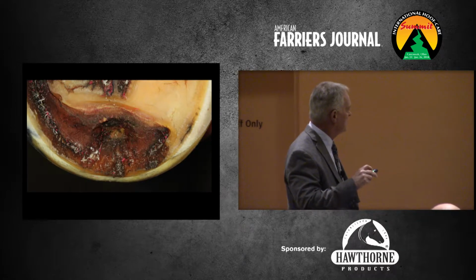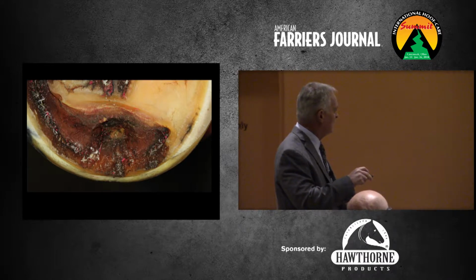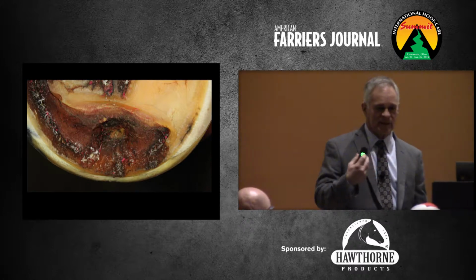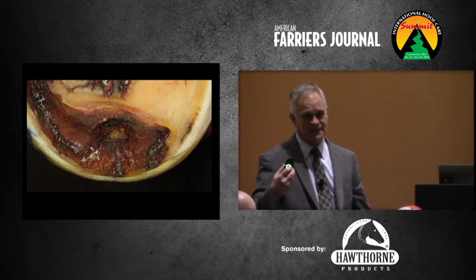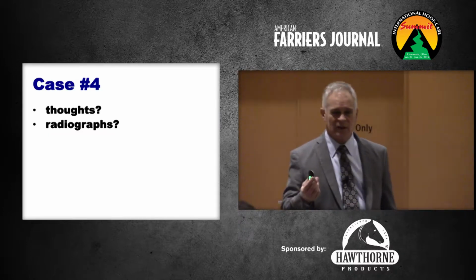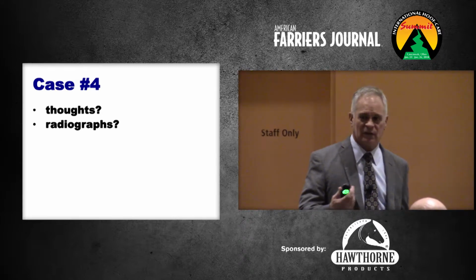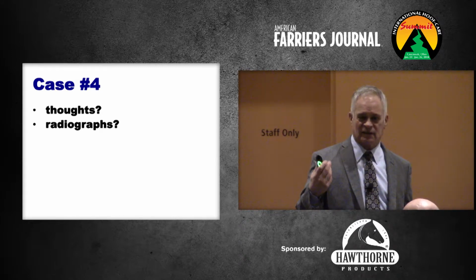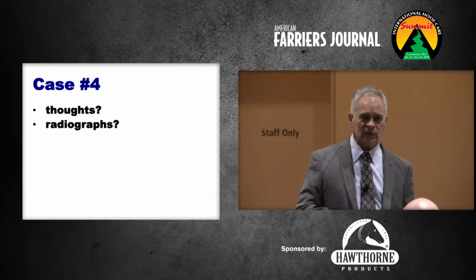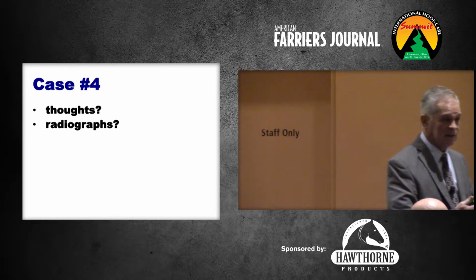Okay, a little closer view, just to test you guys. What's the pink? Okay, it's Play-Doh. It means we radiographed it. Forgot to take a picture till after the radiograph. So what do you think? How would radiographs help you? Owners pressure you to do something about subsolar abscesses all the time, whether they should or shouldn't. Now it's like 3 times. Something's not right? Okay, so infection of the coffin bone, septic osteitis, is a possibility.